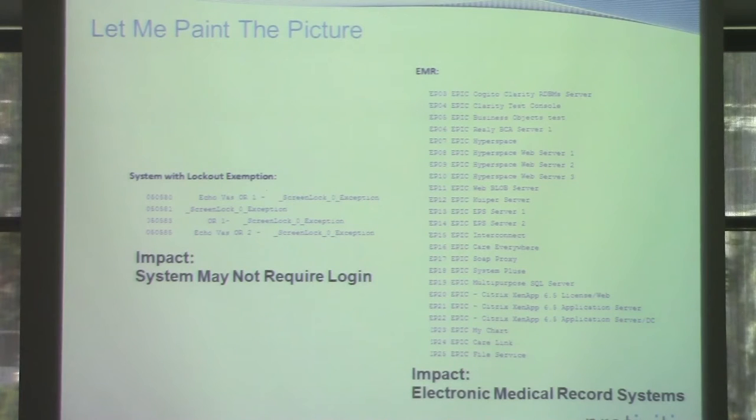This is a misconfiguration. So they could have made the most secure product, and then the healthcare organization screwed it up and didn't implement it securely. Now, the ironic part is that in this case, I worked with that organization after we reported it. But the irony in all of this is that the XP system also happened to be a server that was running a medical device. It was put in by a medical device manufacturer that exposed their organization, so not good.